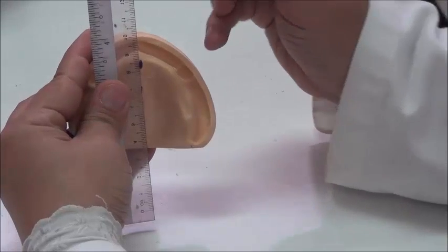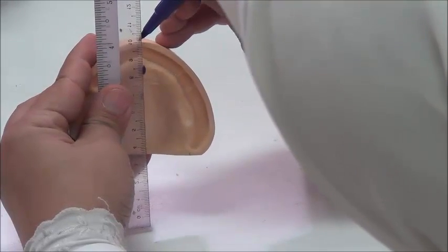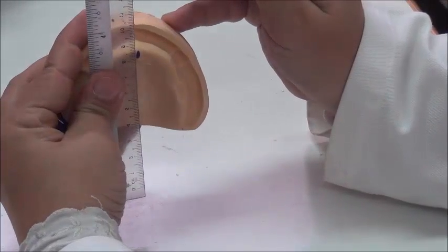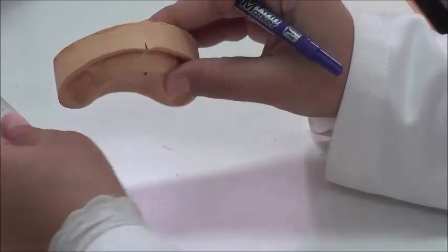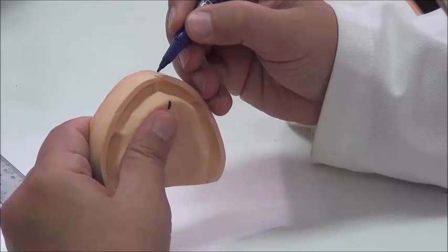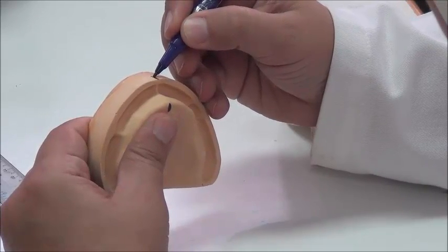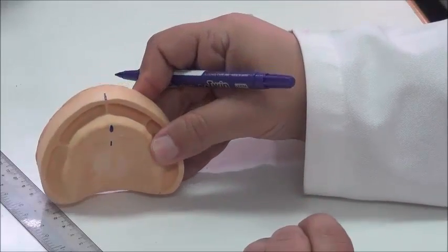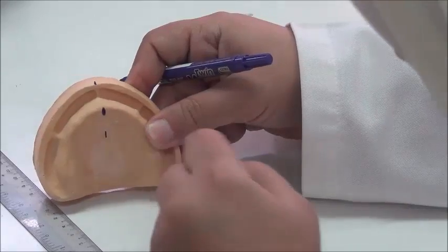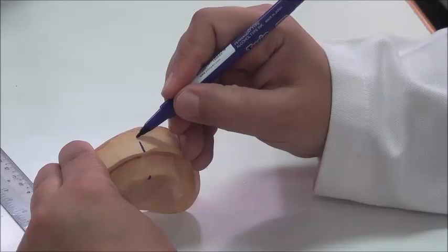And I can now come while looking at the ruler vertically and know where the midline of our cast is, and transfer this mark onto the labial surface of this cast. Okay? So for the cast that we have, it's almost over the labial frenum as well. But this is not the actual situation in many patients, so it's not always corresponding with the labial frenum. Okay? So now I have the anterior midline for this cast. This is the upper cast now.